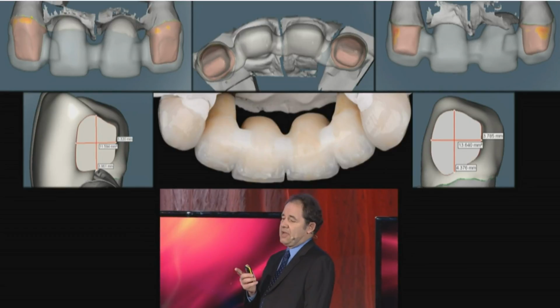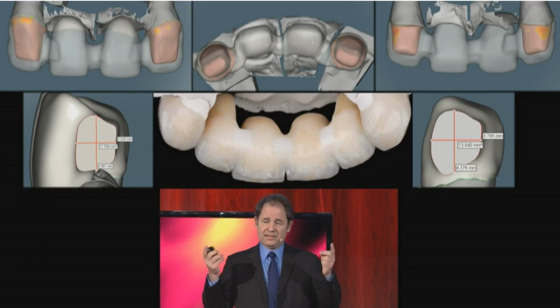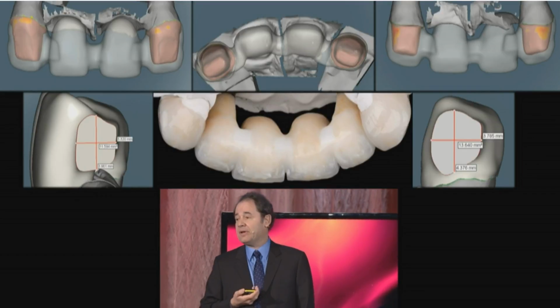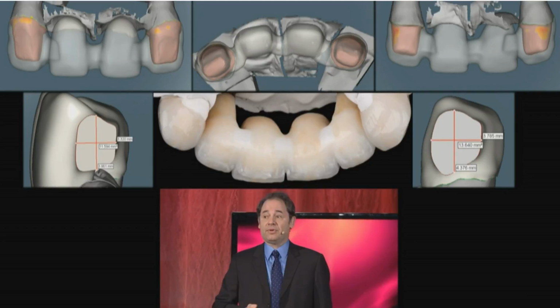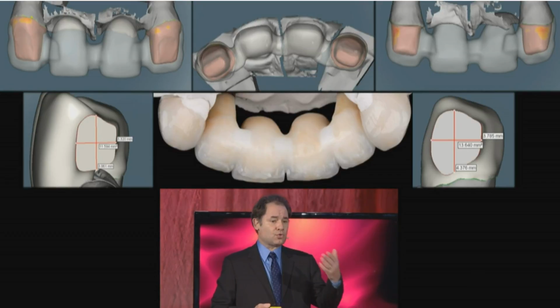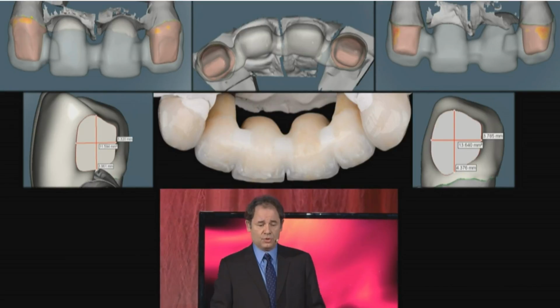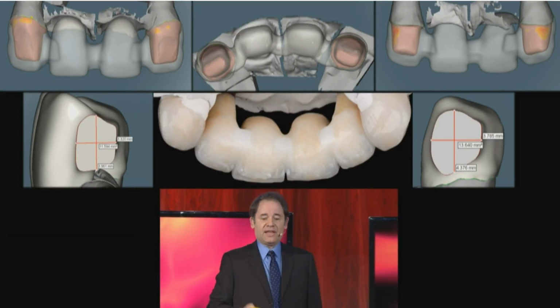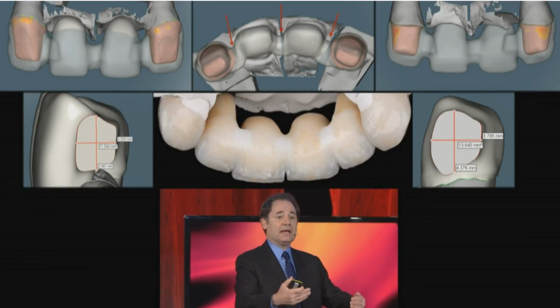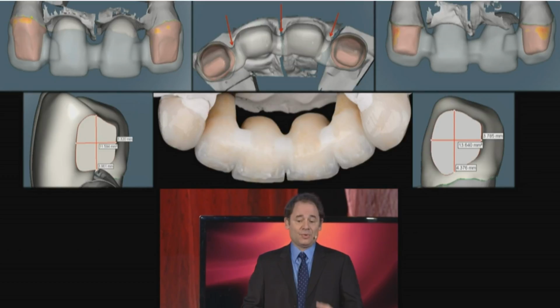So how do you do it? You do it by bringing the zirconia connector all the way out to the lingual. And this is a design I learned in the 70s from John McLean. The late John McLean was my big mentor in ceramics. What he taught us at that time was that the stresses are always in the connectors, and you maximize the strength by bringing struts to the lingual. You get another advantage with that technique: you can bring the embrasures of your framework lingually so that you can develop better aesthetics on the facial. So you have better control.